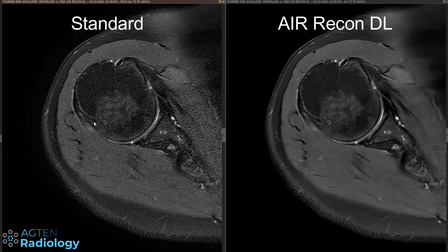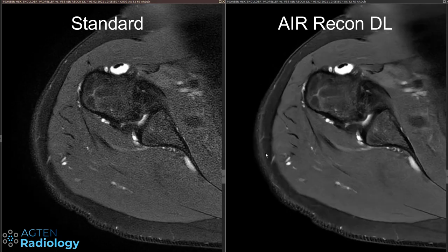Another note: I'm not very deep into the technical stuff or physics of how it works in the background with deep learning. For me it's really just about image quality and what I work with in daily practice. I will not really go into the technical side of things — there is a lot of information out there — and I really just want to show you a few examples of how the images look with Air Recon DL.